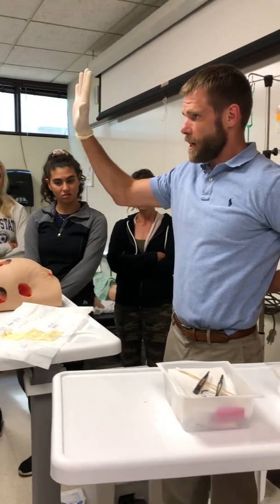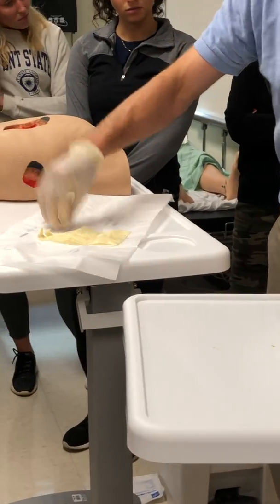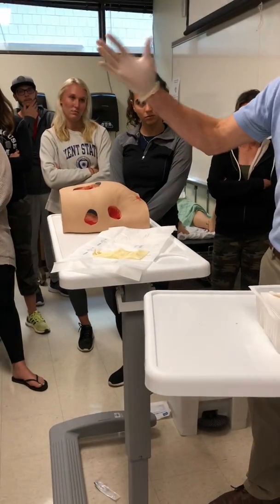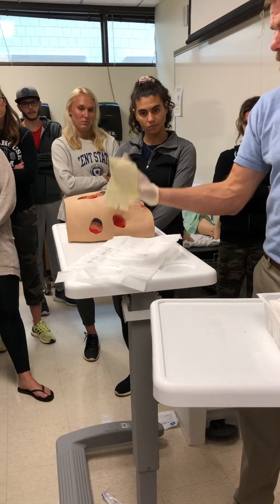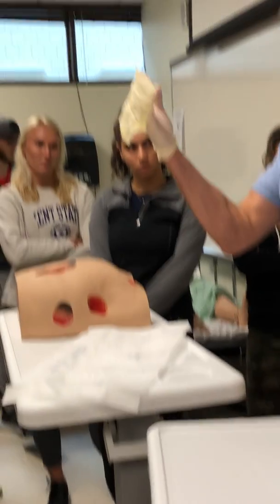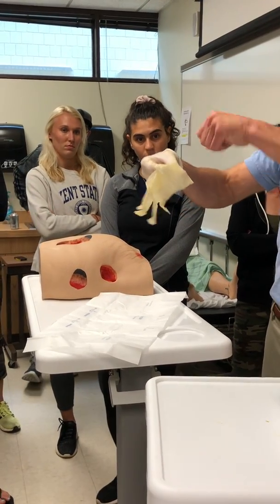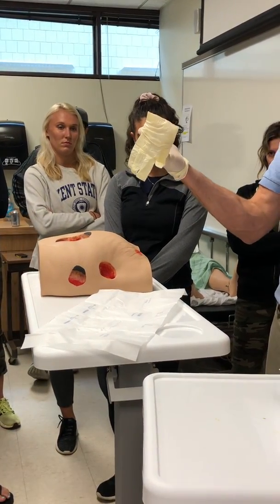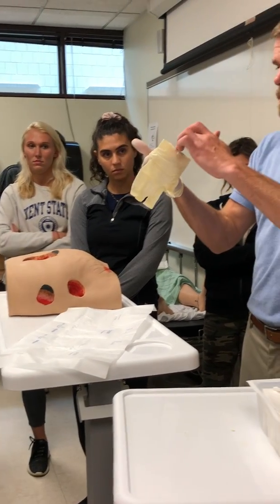Right, you guys see what I'm doing with my other hand? Because I don't want to accidentally contaminate. Okay, sterile to sterile. Is it 100% okay? Put all four fingers underneath there. Get this thumb away. You don't need this thumb. This thumb is useless. Don't do this. Too many of you guys do this, and when you go to put it on, you accidentally touch your skin. You don't need the thumb to put it on. Fonzie thumbs. Hey. Okay, Fonzie thumbs.